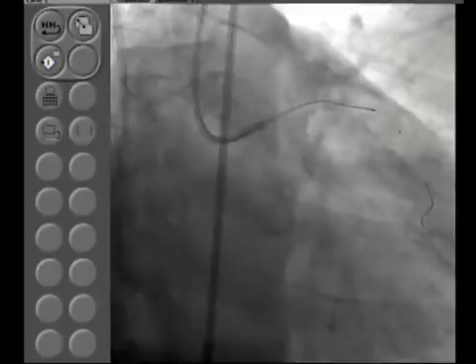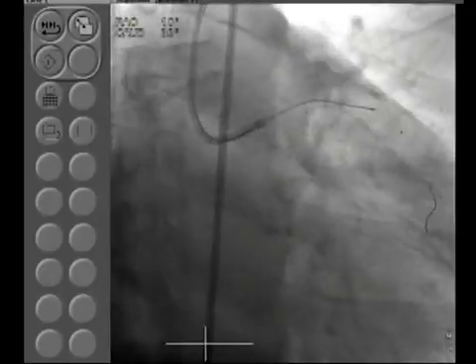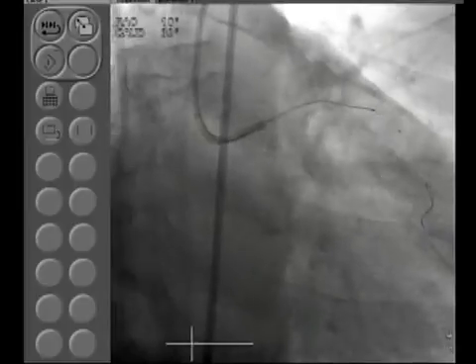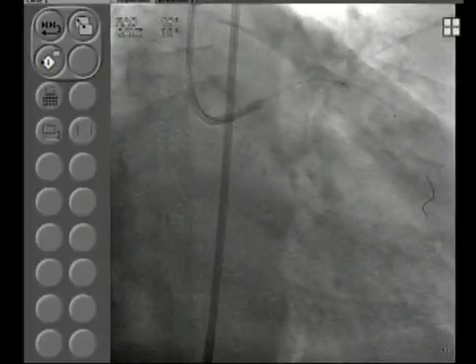So, how much is the use of IVUS at Mount Sinai? Well, actually now it's increasing, particularly in terms of lesion determination, rather than stent expansion, which is rare. Mostly it's for lesion determination, and it's gone to upwards of the high teens.